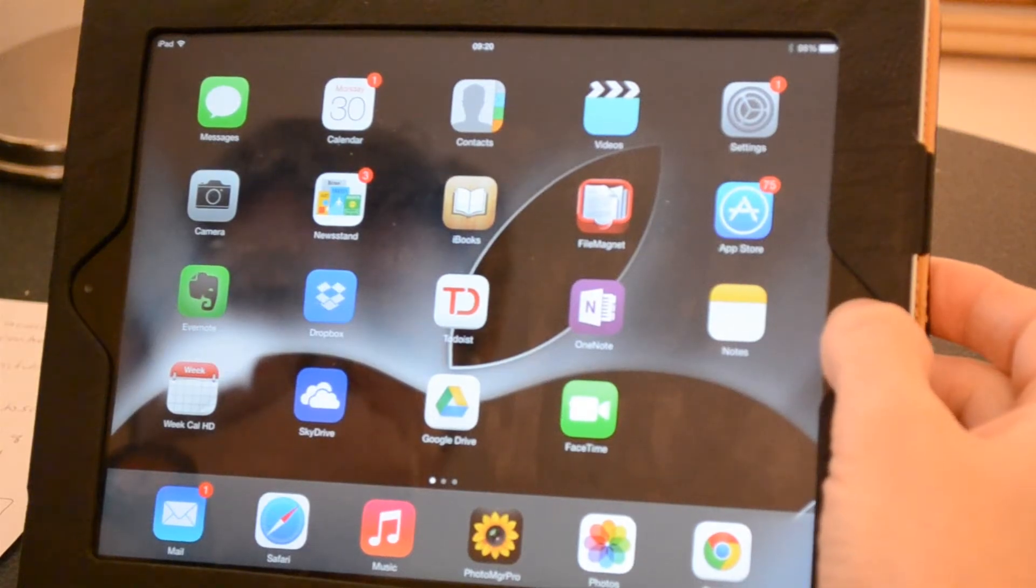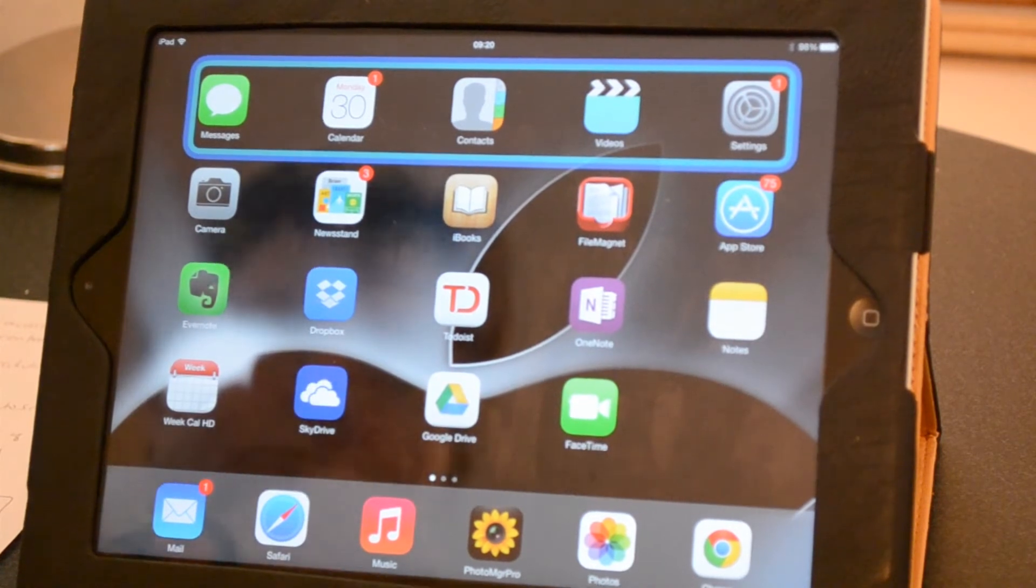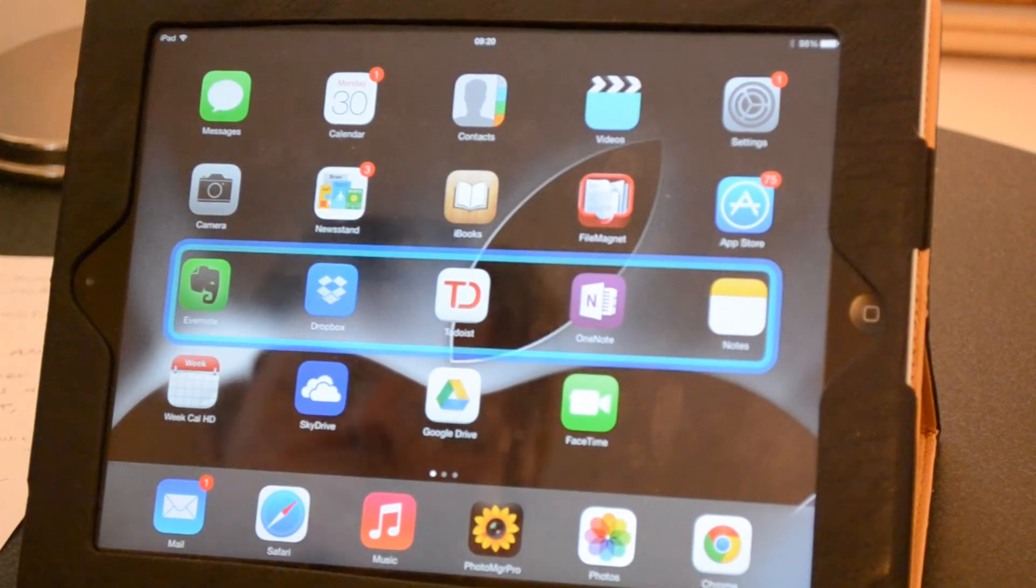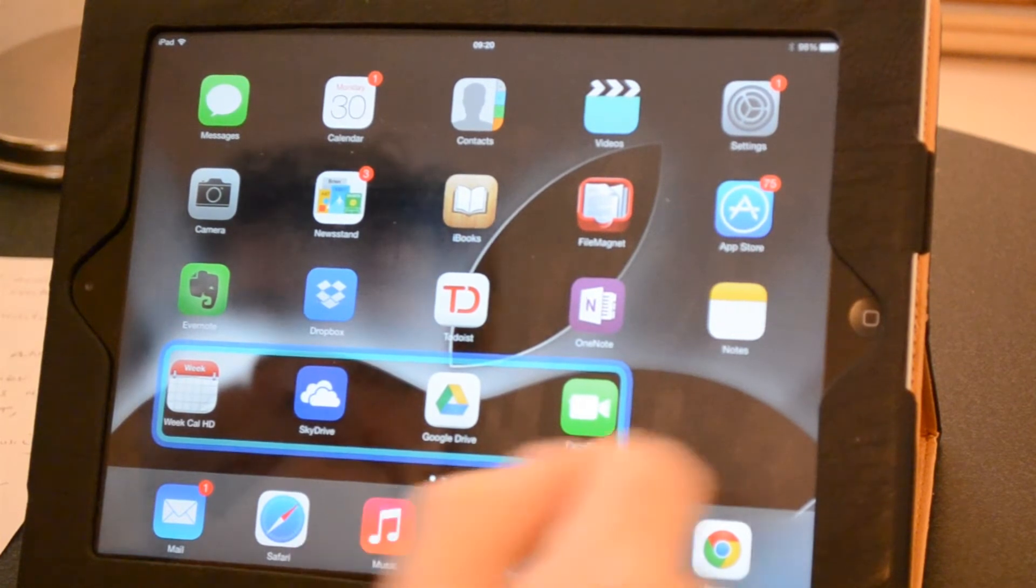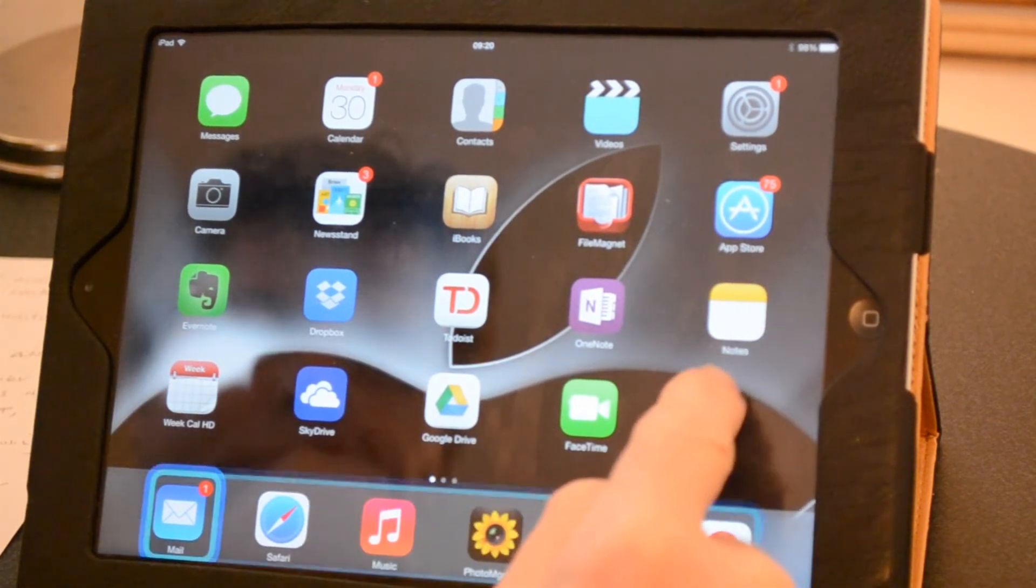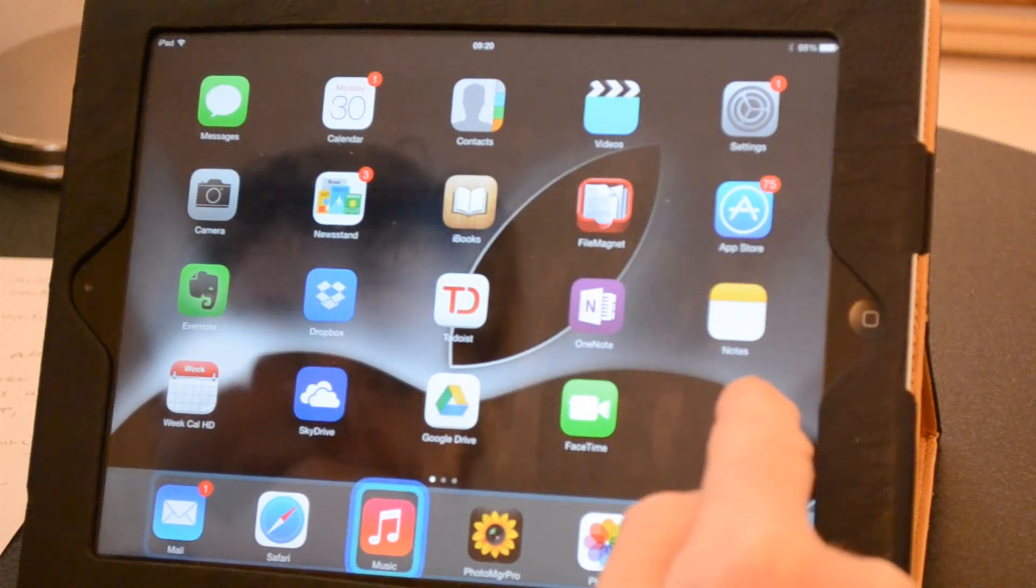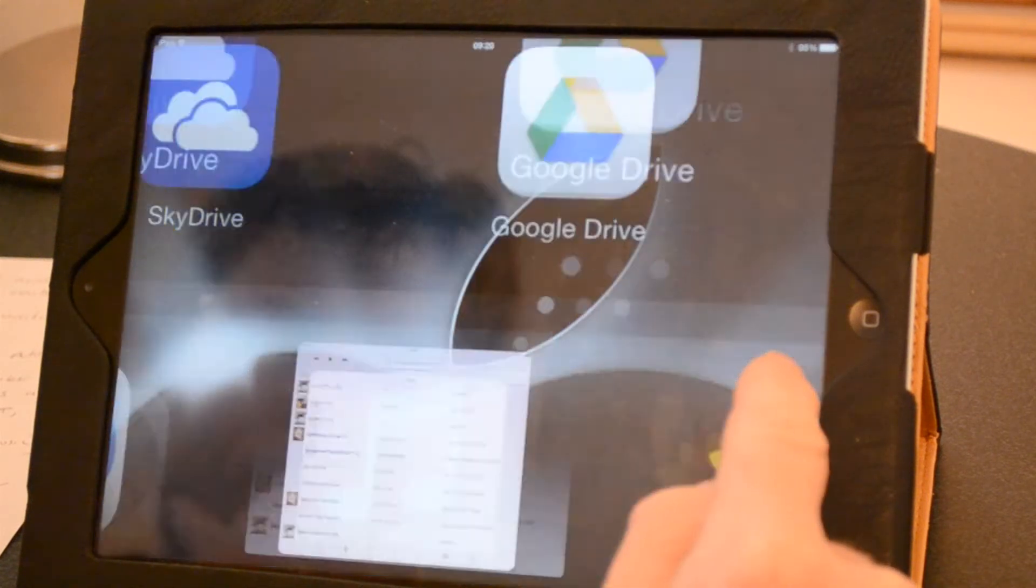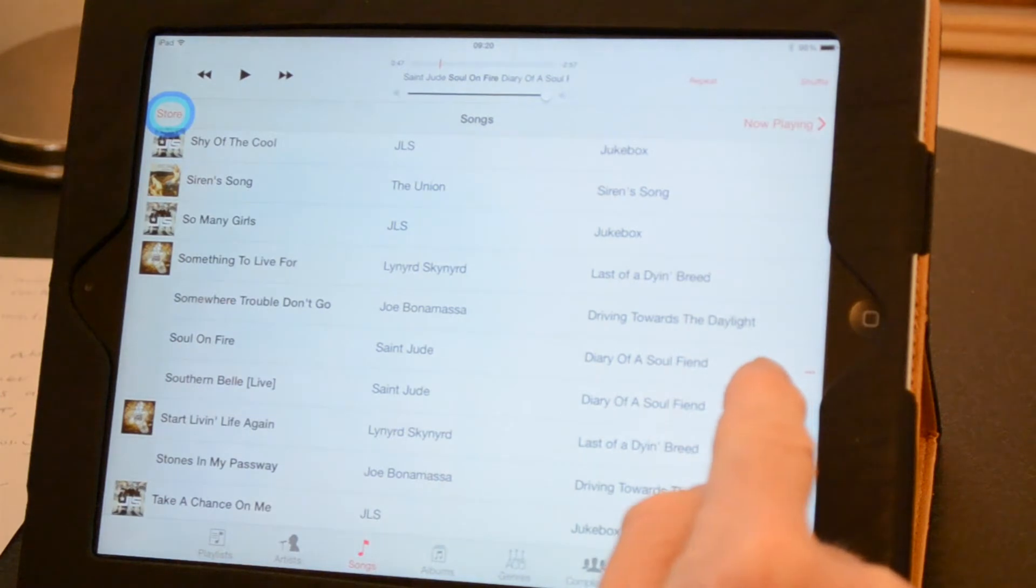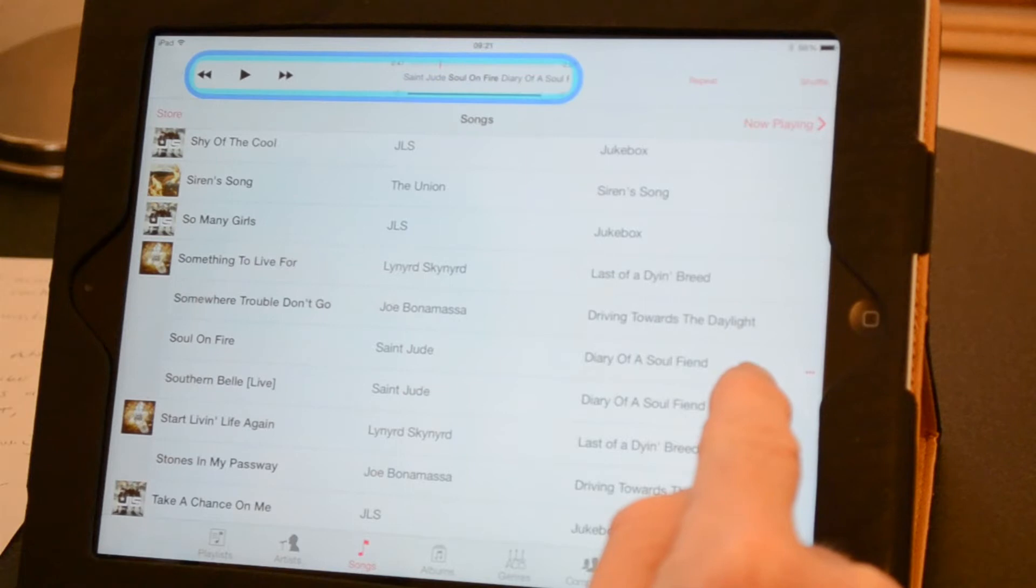Here I've set this iPad up so that a triple tap on the home button starts the auto scan feature. Here it's been set to scan in groups and touching anywhere on the screen indicates your selection. The scanning speed is adjustable and here I've slowed it down a little just for ease of illustration.